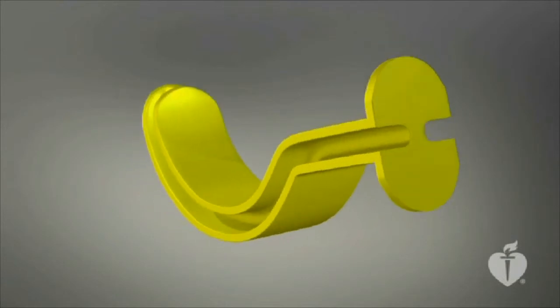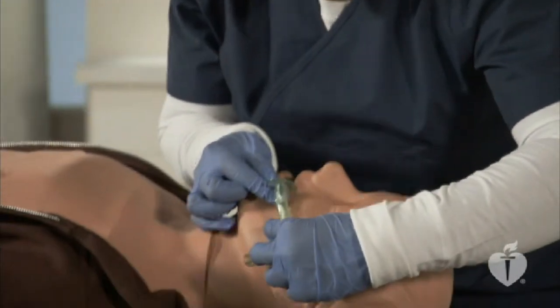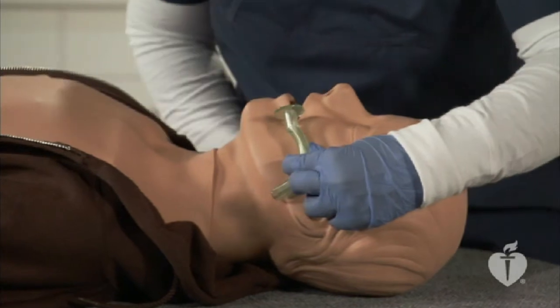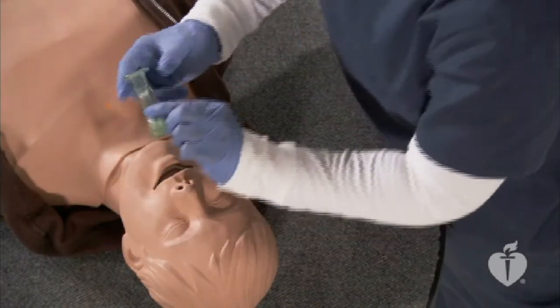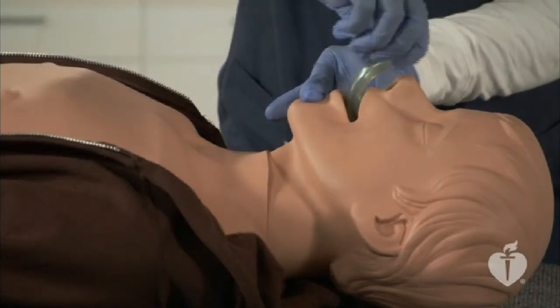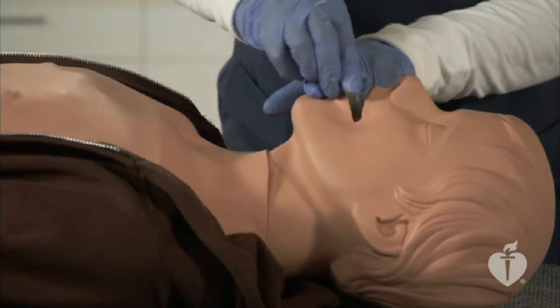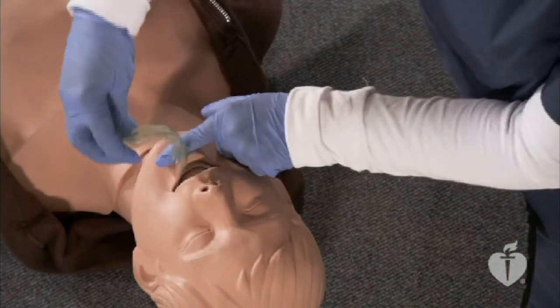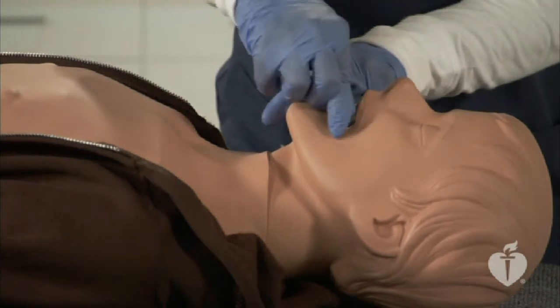Here's how to choose the correct size OPA. When the flange is at the lips of the patient, the tip of the airway should be at the angle of the jaw. OPAs are available in various sizes, with the most common adult size ranging from 8 to 10. One method involves inserting the OPA with the tip pointing to the hard palate. Rotate the device 180 degrees until the tip touches the posterior pharyngeal wall past the uvula. Alternatively, the airway can be inserted sideways and rotated 90 degrees into place.